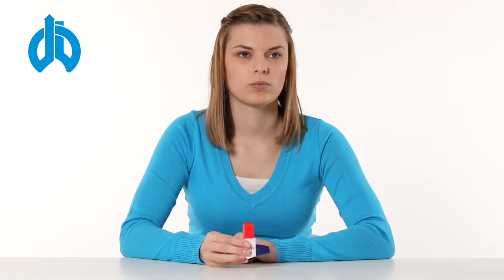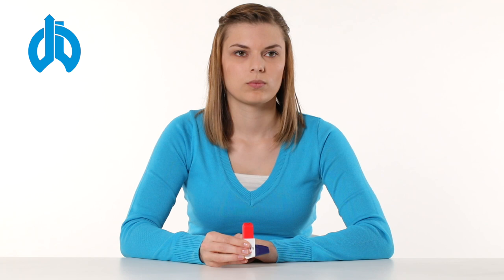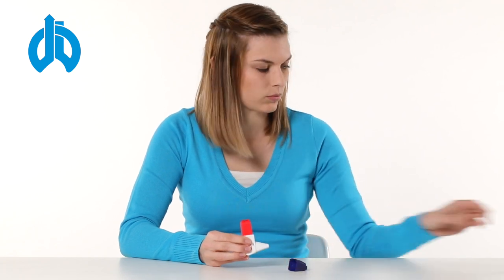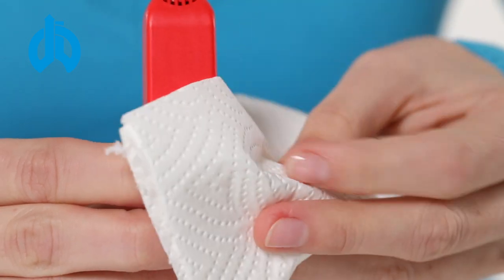Rinse your mouth with water or brush your teeth. Clean the Easyhaler regularly with a dry cloth. Do not use any water for cleaning.